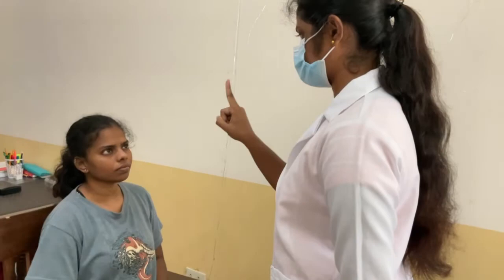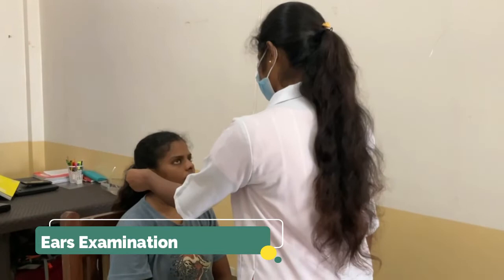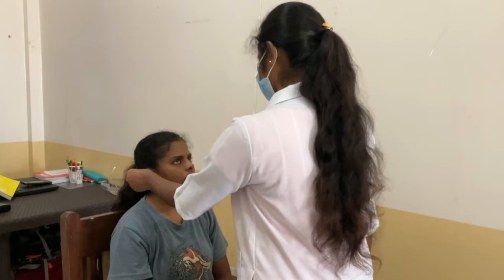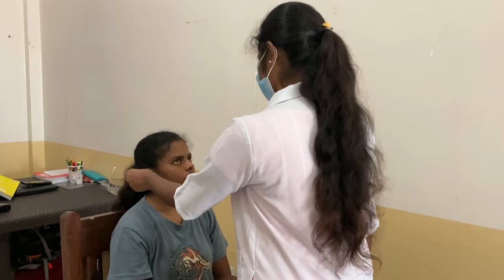The ear examination begins with a hearing test. Oftentimes, a bilateral finger rubbing test is used to screen for hearing loss. Use tuning forks to assess cranial nerve 8 for both air conduction and bone conduction.